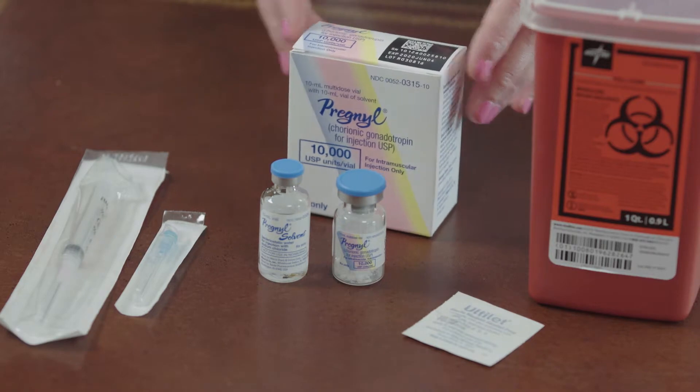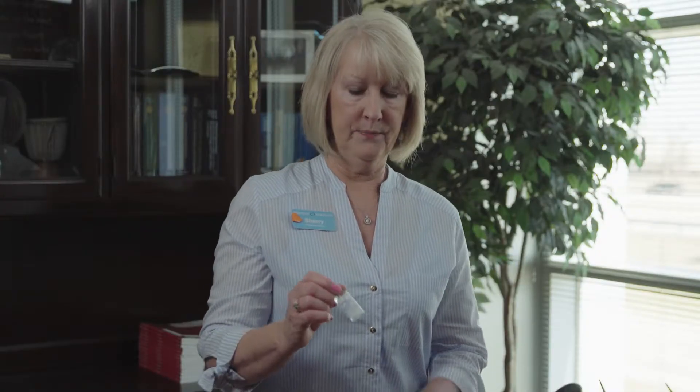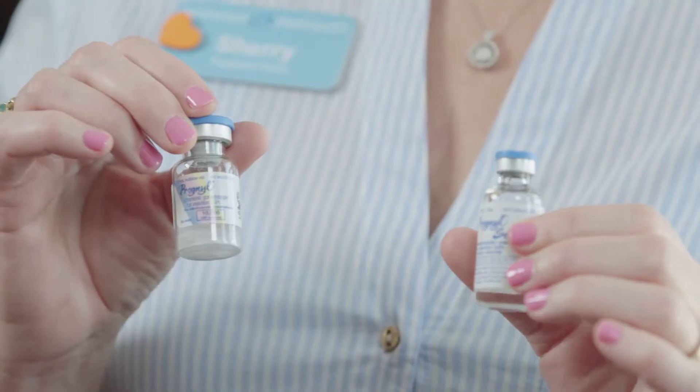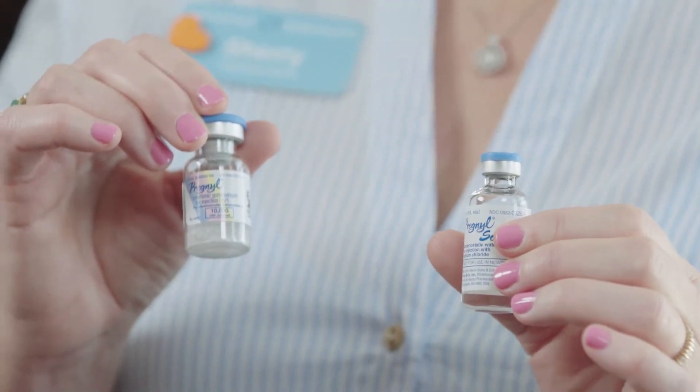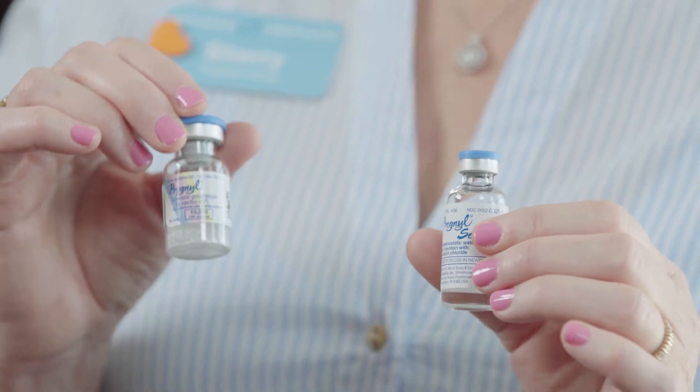In your box of medication is going to be a vial of liquid and a vial of powder, which is the medication. I am demonstrating Pregnel, but as I said your medication may be Novarel or HCG.